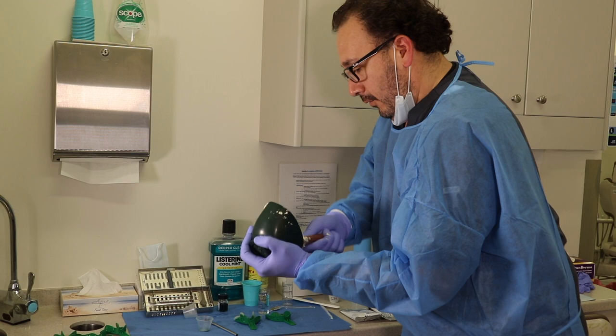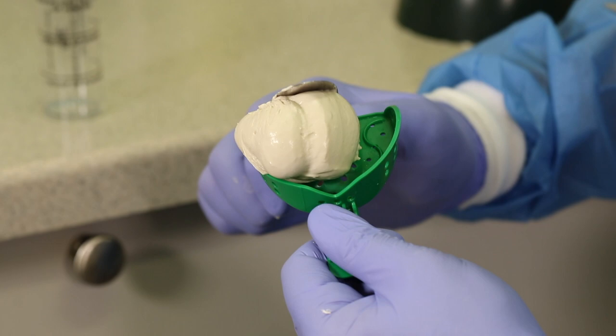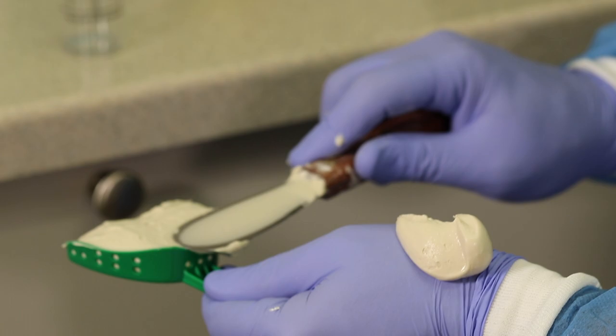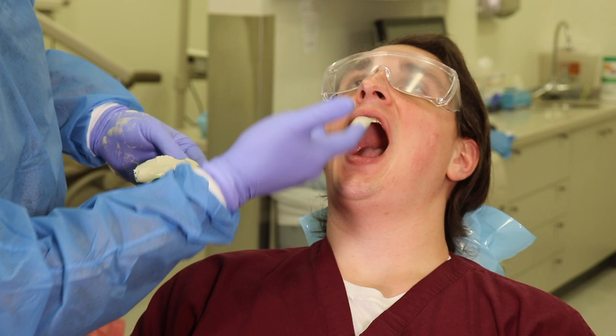On this patient, I'm gonna load the upper tray. As I load the upper tray, make sure I get all of this. And then I do a little bit of extra in my hand. And what I'm going to do is take this extra and go on the occlusal surfaces of my patient's mouth. Okay?